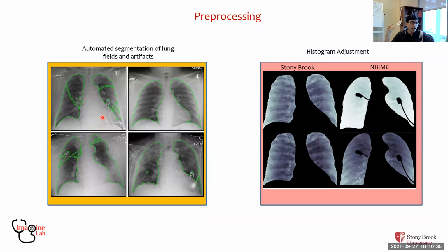What happens if you do that is that a lot of the regions that your machine learning algorithm learns its signals from might be regions outside the lung, or regions where you have, let's say, artifacts such as EKG leads and other wires, pacemakers, and whatnot. So we want to make sure that we remove these noisy artifacts before we can extract imaging measurements from these regions.